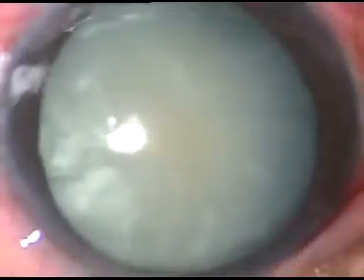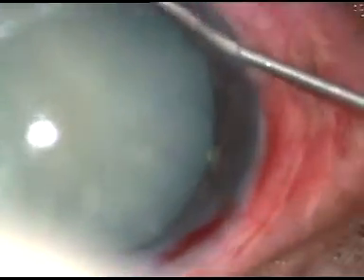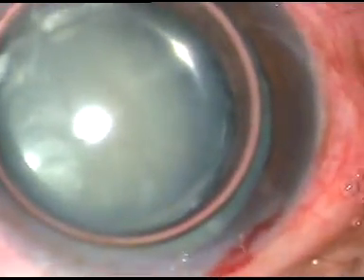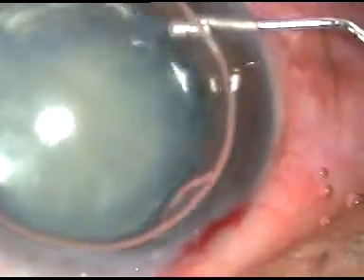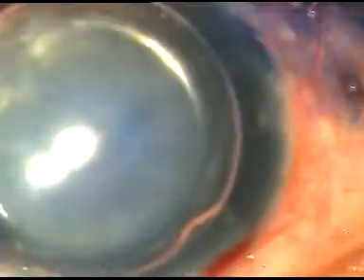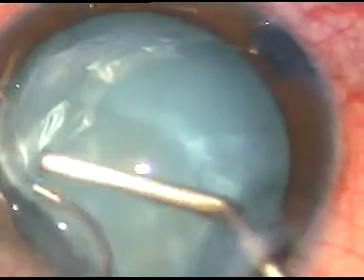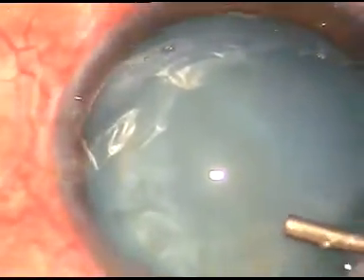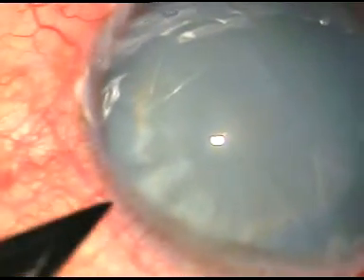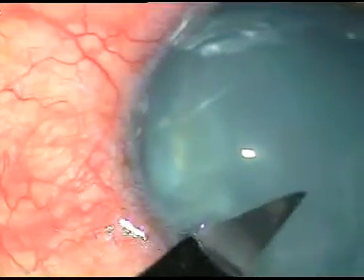A big air bubble is injected in the anterior chamber. Now trypan blue dye is sprayed over the anterior capsule of the mature cataract. Viscoelastic substance is injected into the anterior chamber, and another paracentesis incision is made at 1:30 o'clock.